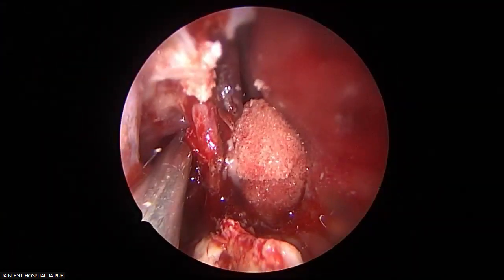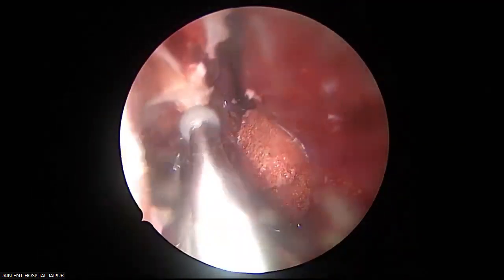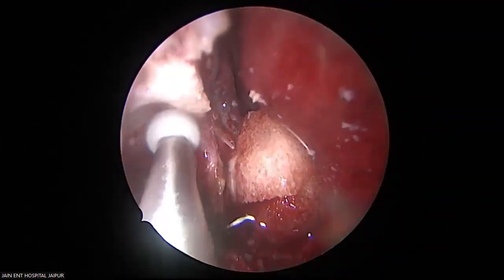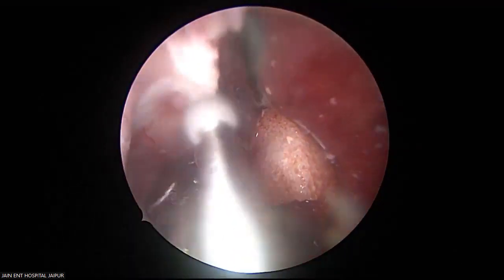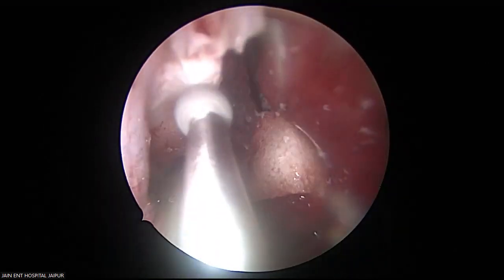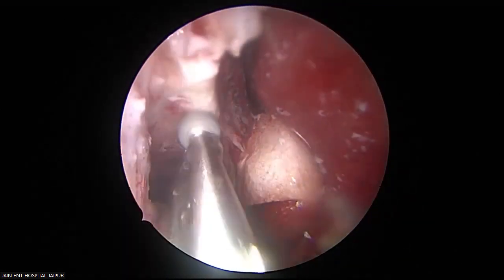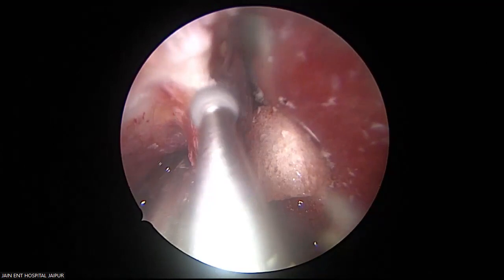Drill. See how superiorly you are supposed to go. There's a very important catch point. And this drilling is so precise. It really cannot be done without such a drill. So precise.